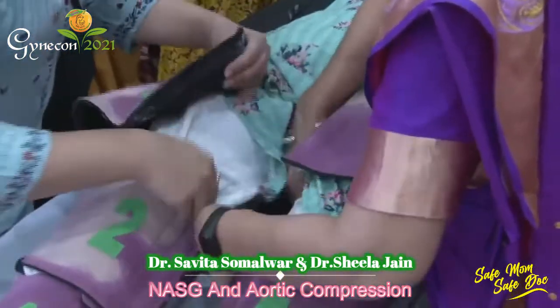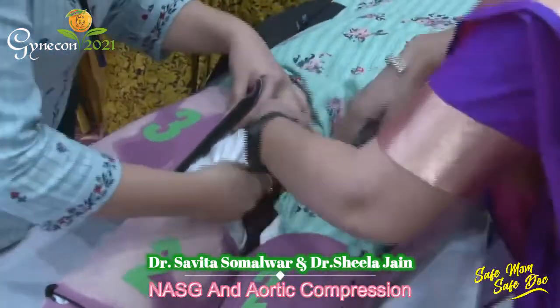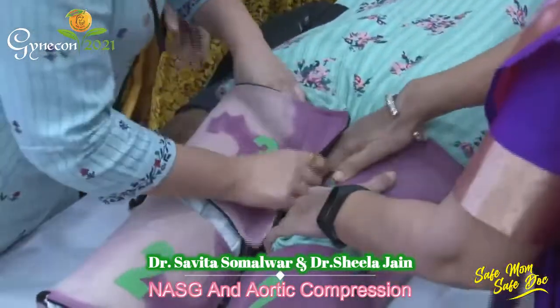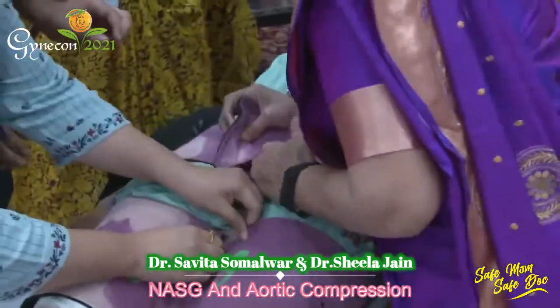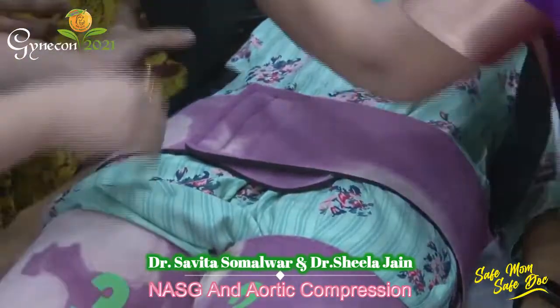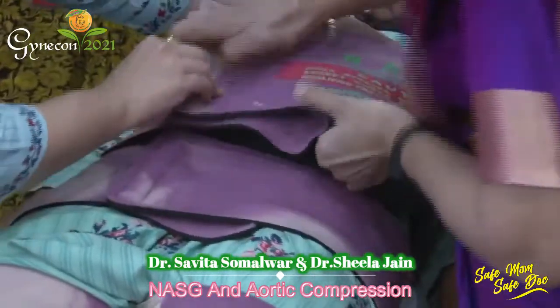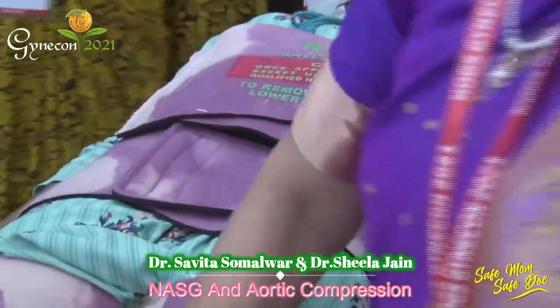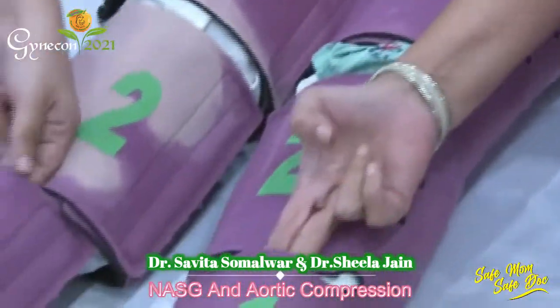Ensure that the knees are free so that you can flex them. Then segment 4 is closed tightly across the pelvis. Segment 5 is closed over the umbilicus — ensure the pad is over the umbilicus — and finish by closing segment 6.